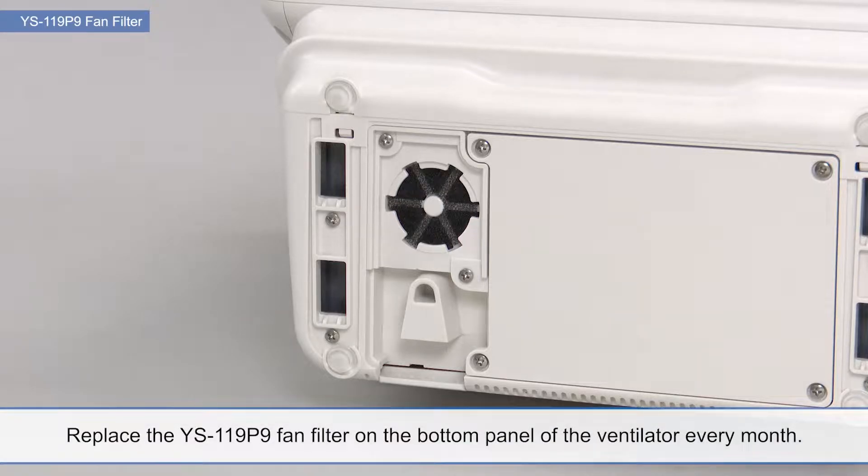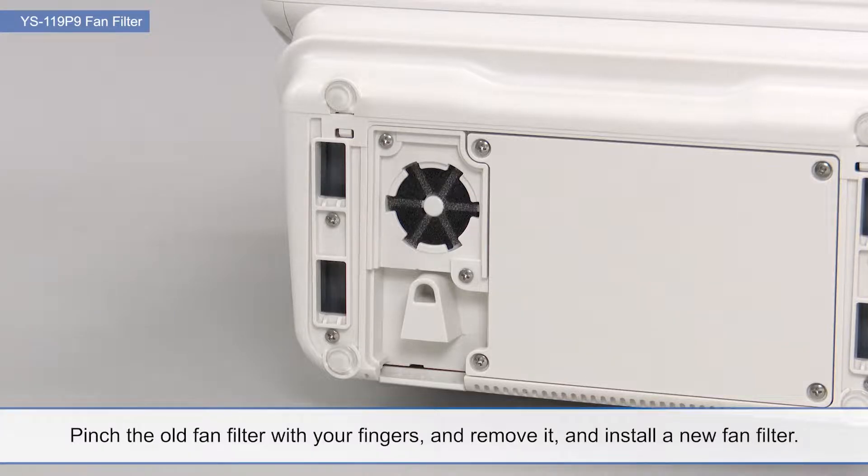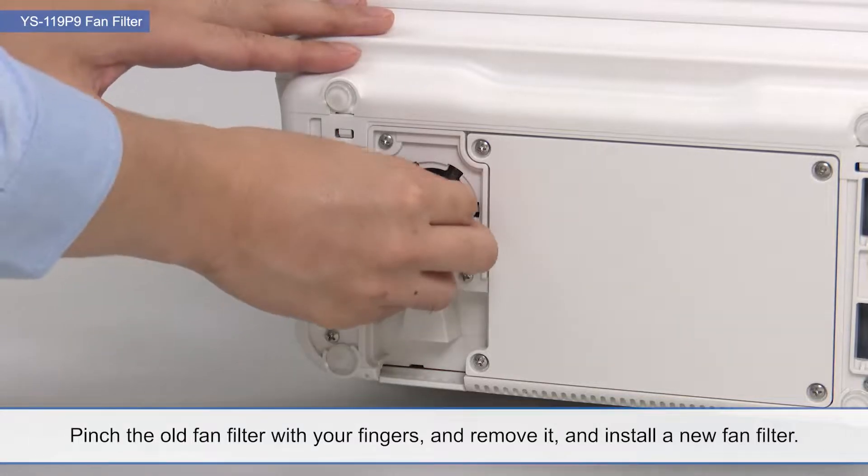Replace the YS-119-P9 fan filter on the bottom panel of the ventilator every month. Pinch the old fan filter with your fingers, remove it, and install a new fan filter.